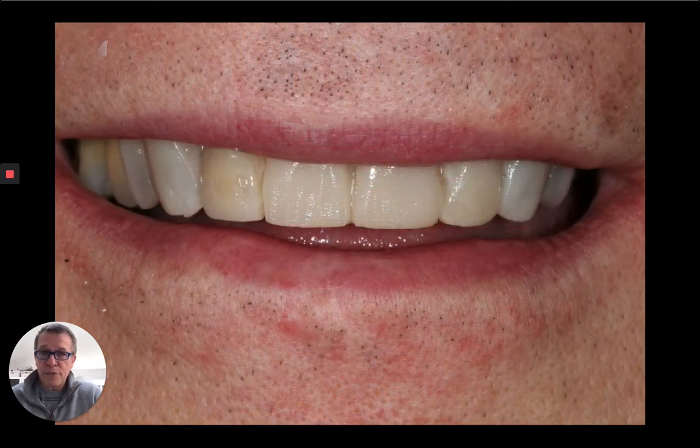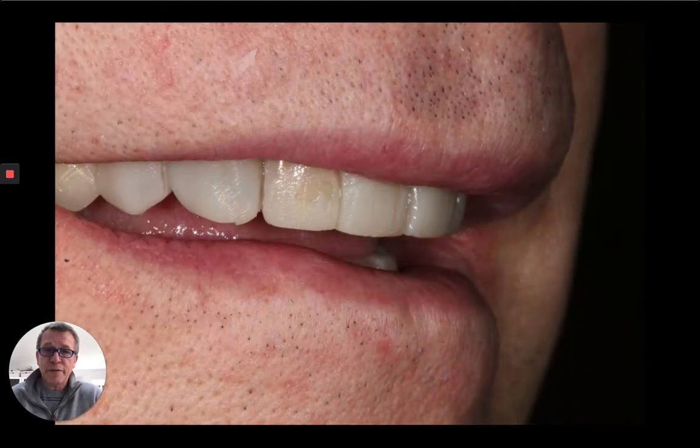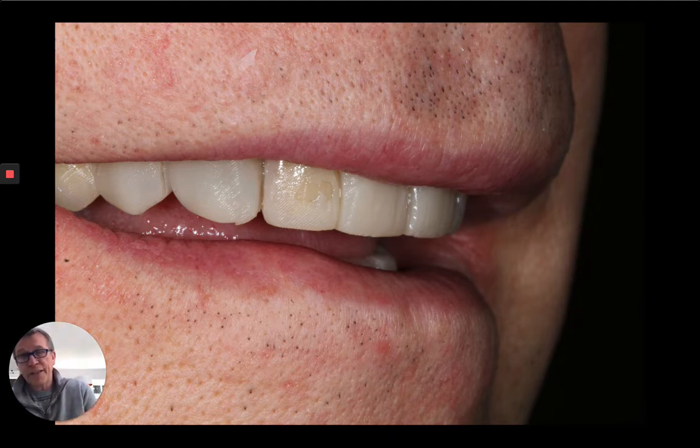We can look at the smile again, and you can see where there's bits of tooth poking through, because we're really not going to be doing much in the way of adding in those teeth. So it really gives us a good perspective and really helps the patient see exactly what it is they're looking for. So you can see here as well, these are things that we're learning. If you look at this wax-up, you'll see almost like a fingerprint on the surface, and that's the marks from the printing process.